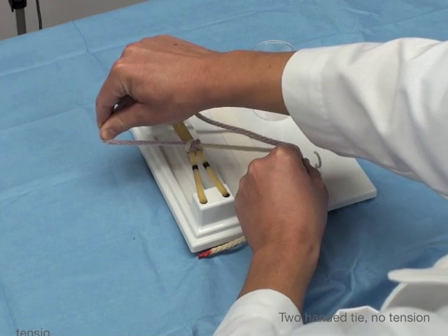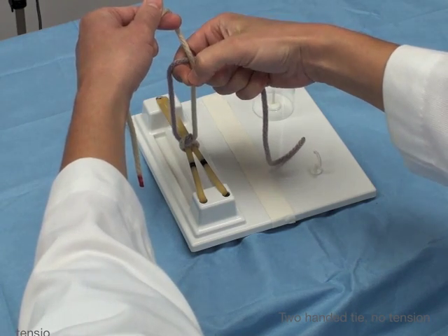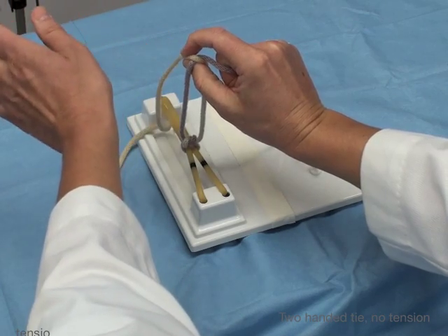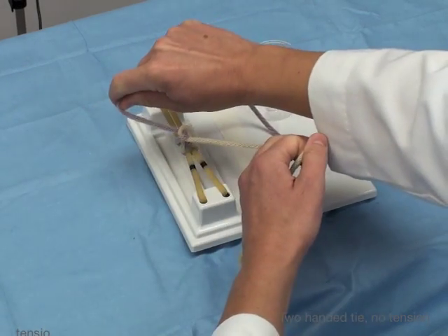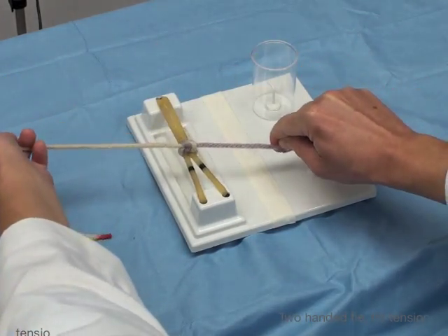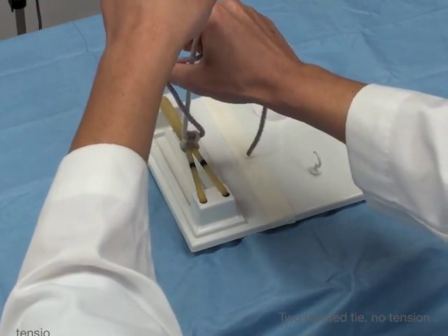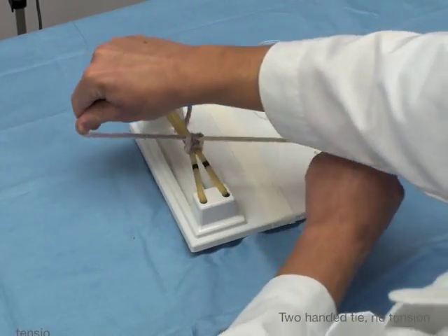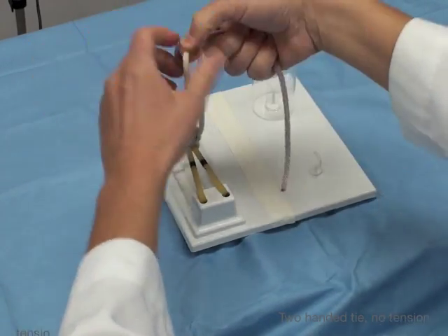This sets yourself up for the next throw because you do your pistol, make your cross, perfect sign, push it through, hand it off, push it through and bring it down flat. If I cross over it's not going to be flat — bring it down flat. Hook with my thumb to the midline, make your cross, perfect sign, push it through, pass, cross your hands over, pistol, perfect sign, push it through and down.